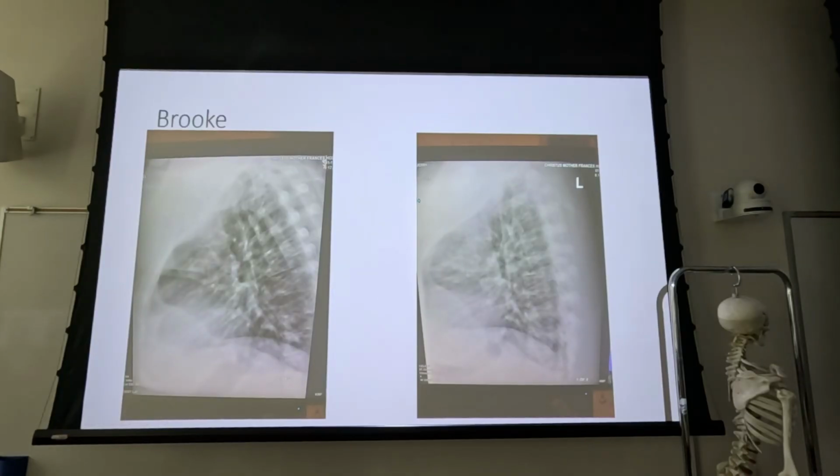Also, marker placement. Some people get kind of uptight about the marker placement. I need it anterior versus I need it posterior. It needs to be on the lateral side of extremity work. You know, just a lot of stuff. My opinion on marker placement is get it on the image and out of the way. Outside of those two things, I don't care. I really do not care where it is, providing it's marking the proper side.